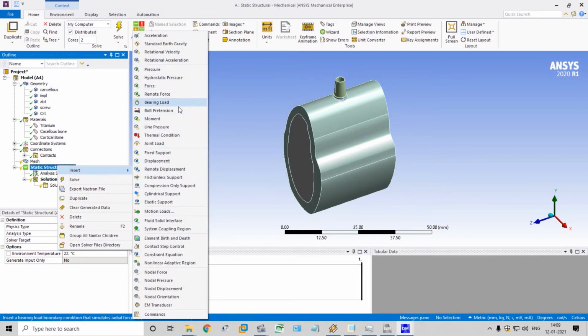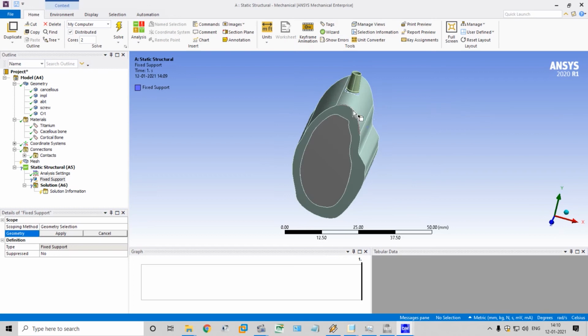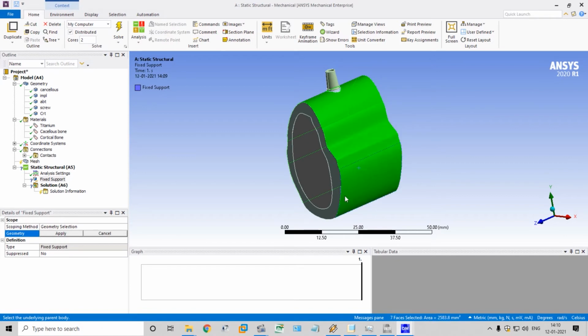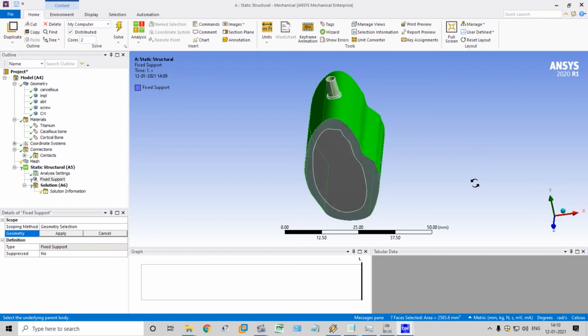Insert fixed support. While applying force, the model should not move. It should have a standard support like this. So which axes and which planes should have the fixed support? That's selected. This one, press control and click this one. Right, apply.